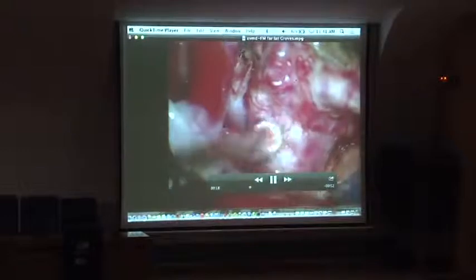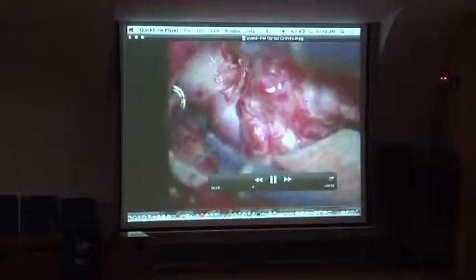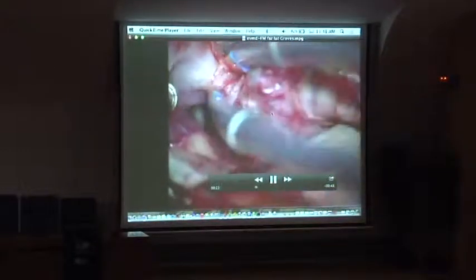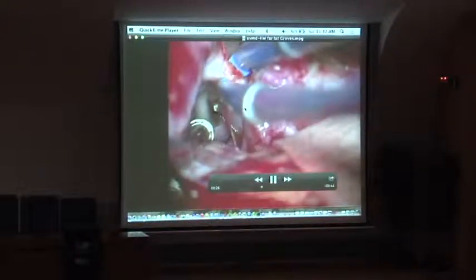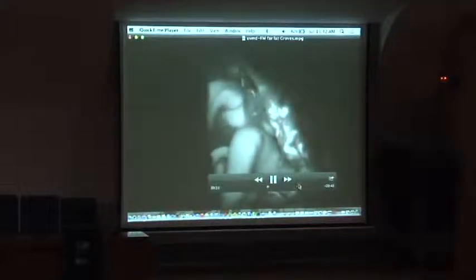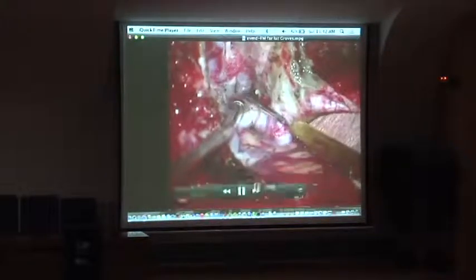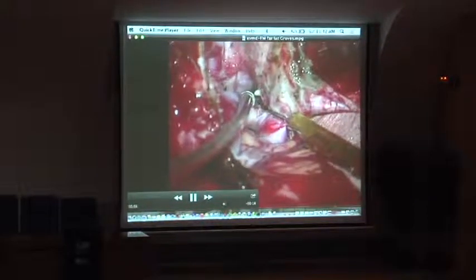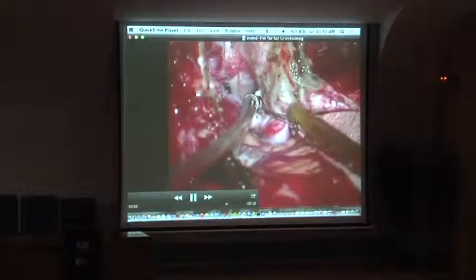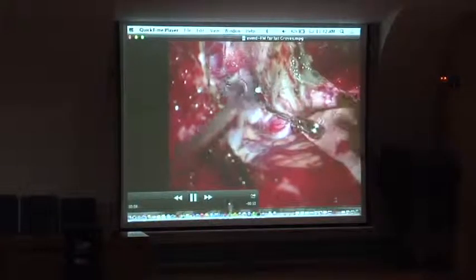That's what the key is. And you see all these dilated arterial feeders here that you don't have to bother about. You got to make sure you're identifying the vertebral artery because you don't want to clip the wrong vessel. But here you see the ICG. And here you see all we're doing is clipping the foot of the vein right there. And all these dilated vessels will go away.